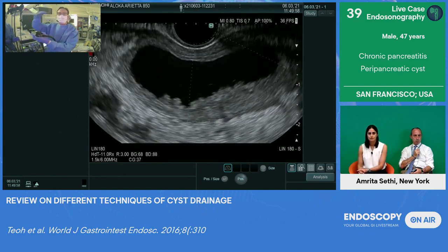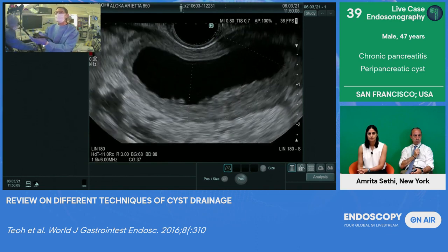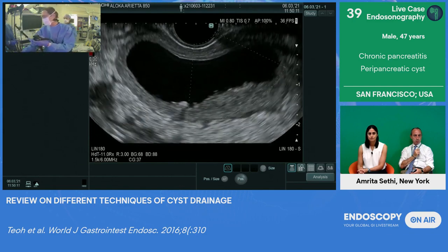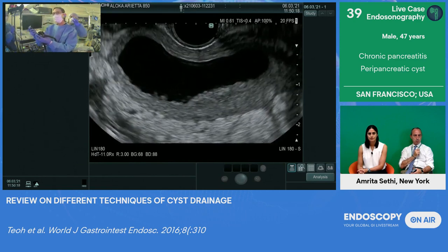So remember, when the flange opens up, and this is going to open up to a diameter of almost 3 centimeters, then you don't want to have that flange close to a vessel if possible. All right, so I'm going to turn the Doppler off now, and we will proceed to advance the sheath out.